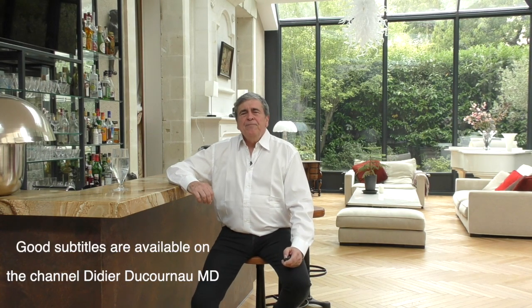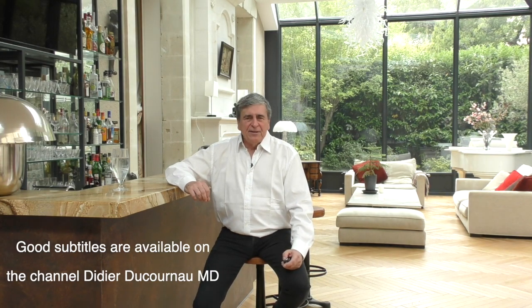We are going to see how to examine a retinal detachment. What is the purpose of this examination? It is to search, just before the operation, all the clinical details that will allow us to adapt the best strategy. And what is the best strategy? Well, as for all functional surgeries, it is to exert the minimum and sufficient trauma to allow anatomical healing with the least possible complications and the greatest functional recovery. All the challenge is there.